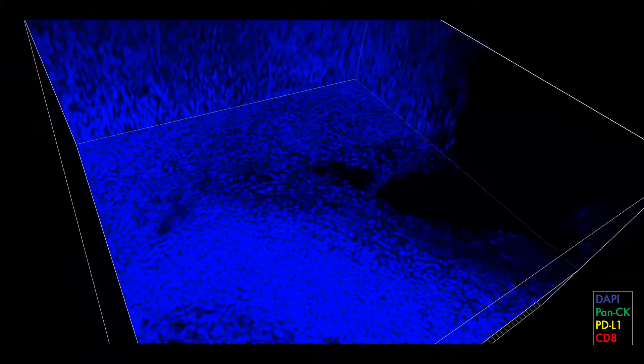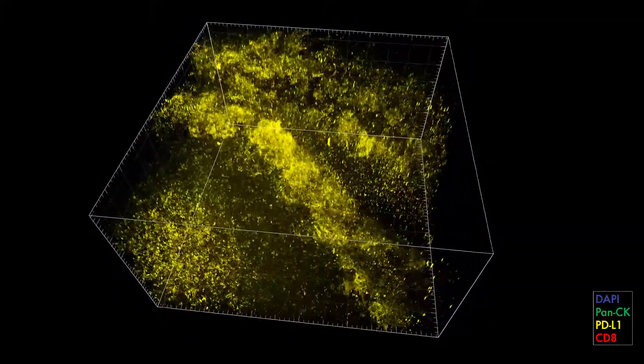First, DAPI stains all the cells in our tissues. Our AI method can automatically process this information and represents each cell nuclei with a different color.